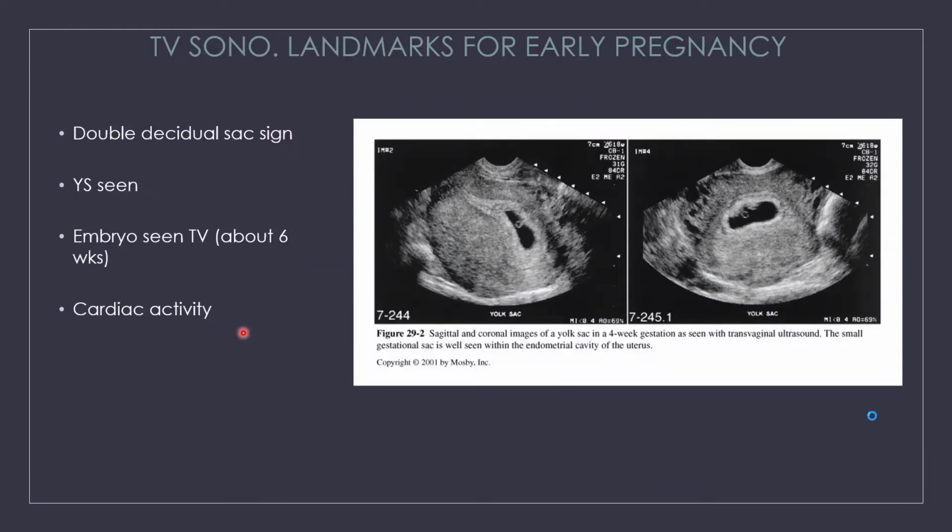Okay, some of the sonographic landmarks in an early pregnancy. I want to just mention these because as you start scanning, everyone is going to look a little different. No one client is going to look the same. Now, the more you scan, the more things will start to look the same because you'll start to recognize things, okay? But in the meantime, I want to introduce you to these terms.